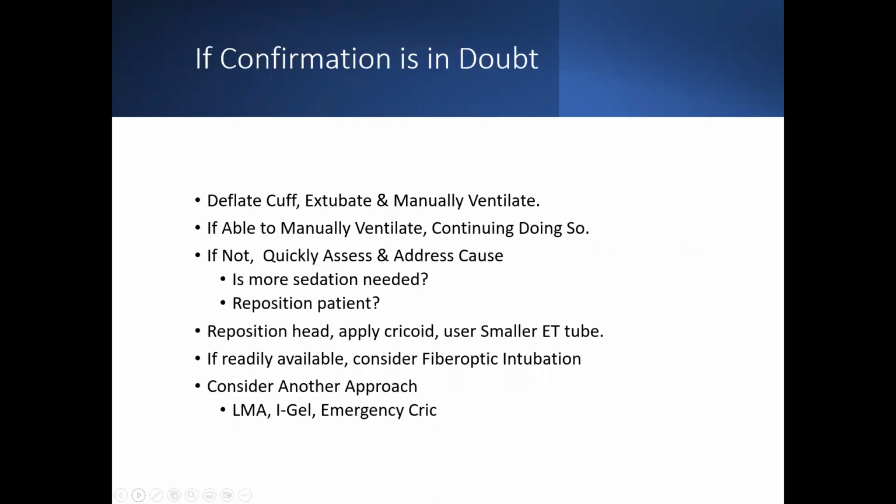If confirmation is in doubt, deflate the cuff, extubate, manually ventilate. If able to manually ventilate, continue doing so. Maybe they need an artificial airway. Maybe you wait for the anesthesia to come. If not, quickly assess, address the cause.